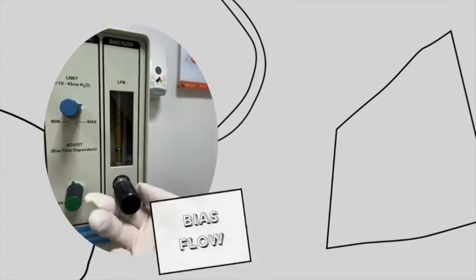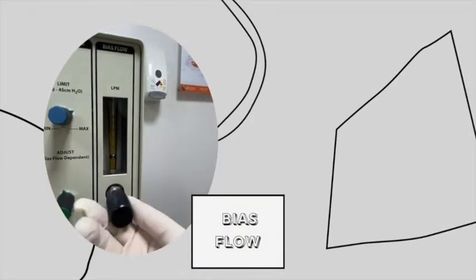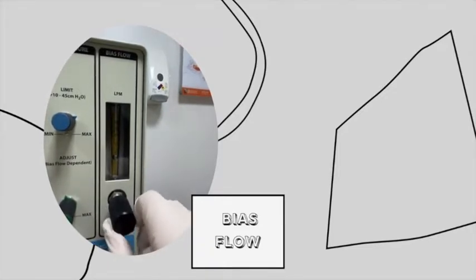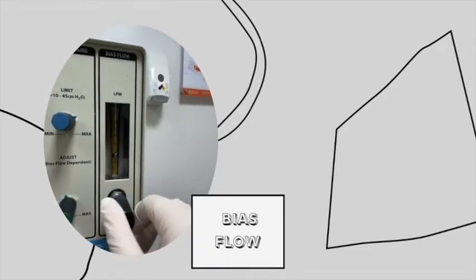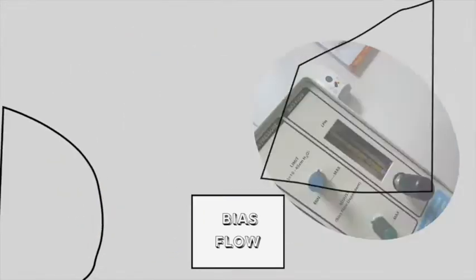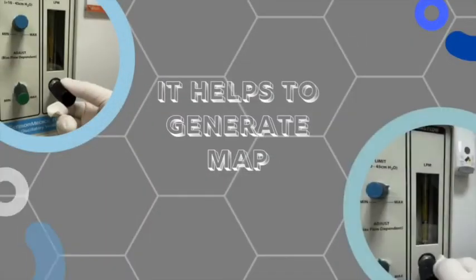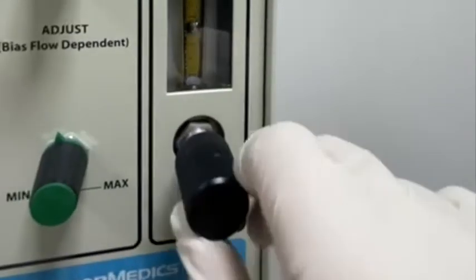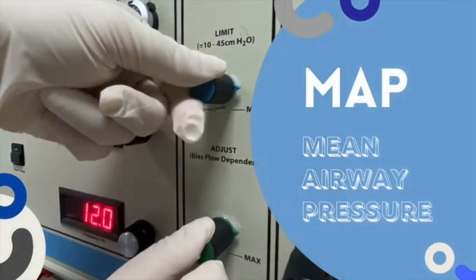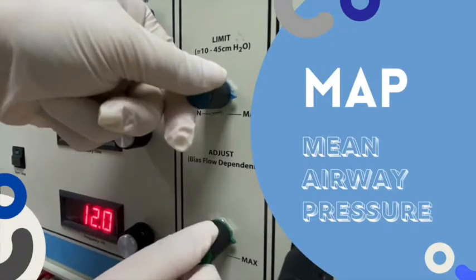Here we have the bias flow, which is a continuous flow of gas responsible for replenishing oxygen and removing carbon dioxide from the patient's circuit. The initial bias flow is 20 up to 60 liters per minute. It also helps to generate the mean airway pressure. The MAP, which refers to mean airway pressure, turn the mean pressure limit and adjust it to the max.